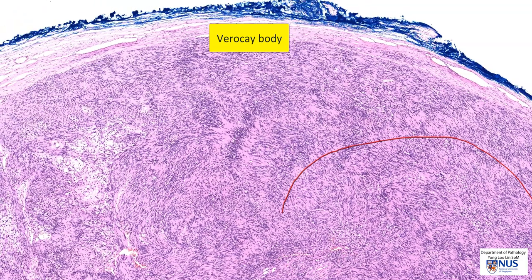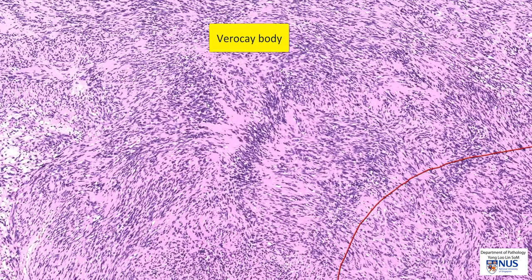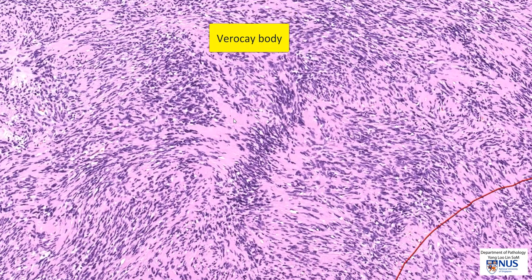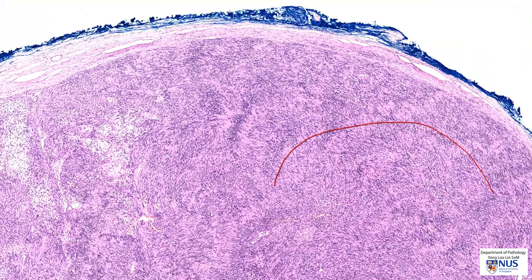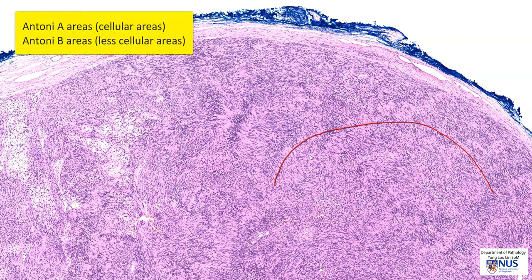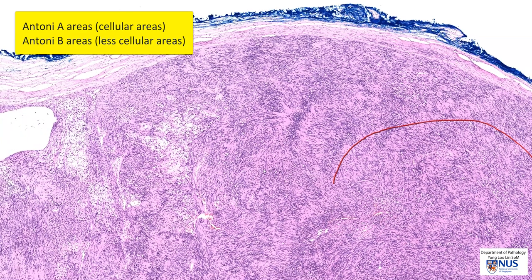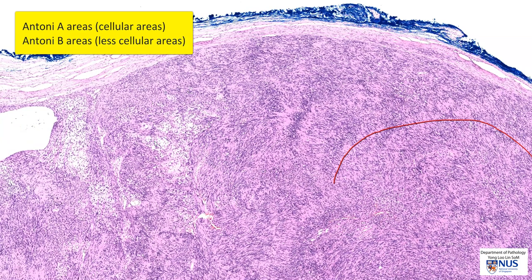We have another example here with a nuclear palisade and another palisade here, and this pinkish fibrillary material — so this is another Verocay body. Usually, Verocay bodies are seen in the more cellular areas. The more cellular areas of a schwannoma are known as Antoni A areas, whereas the more hypocellular, looser areas are known as Antoni B areas.